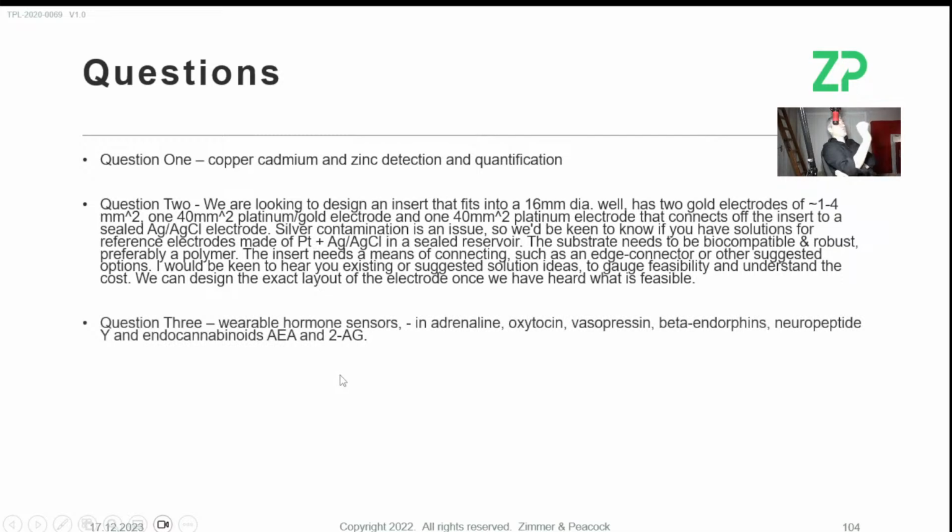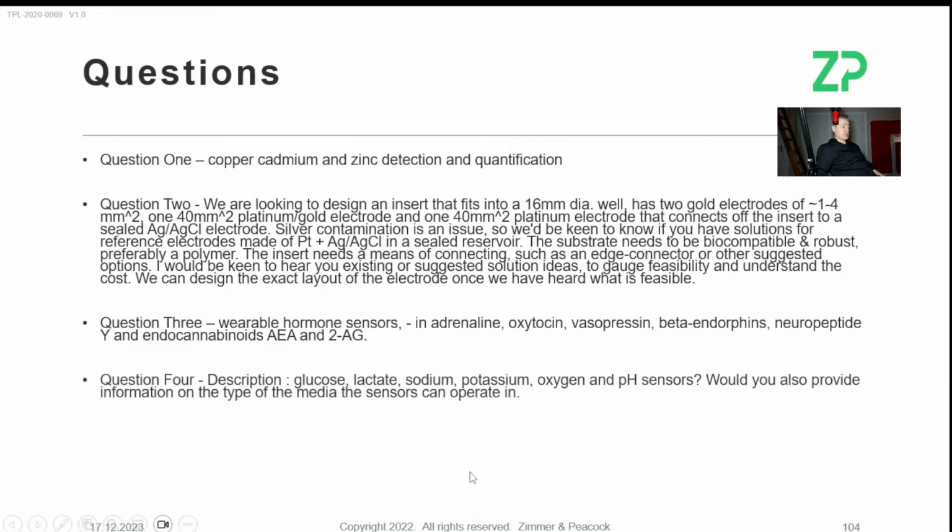Question number 3, making a wearable sensor for cortisol. We are doing it. It is implanted, it is in fish, but that has taken us several million euros to do. We're not ready to do it in humans unless there is some funding in place. If you came back to us and started talking about measuring testosterone in saliva, we could have a slightly different conversation about that, because it is always easier to do point of care testing or discrete testing rather than continuous testing.